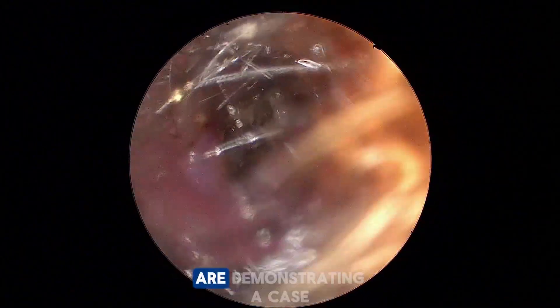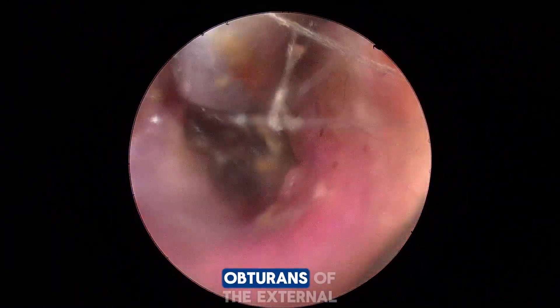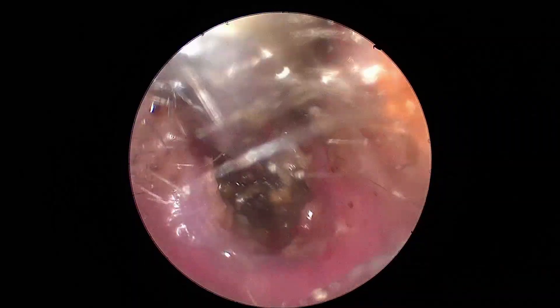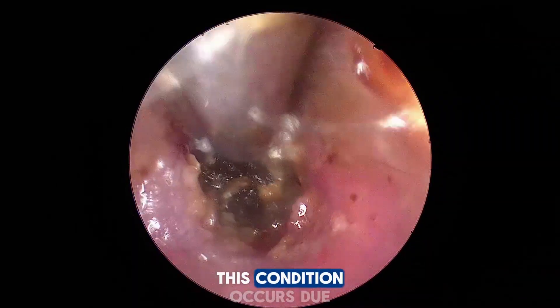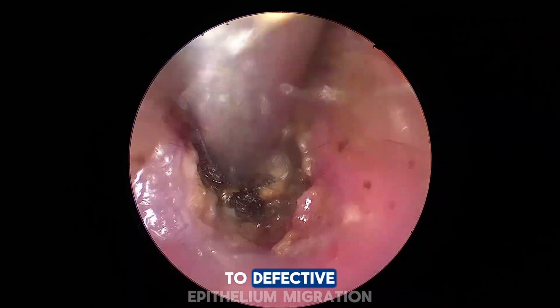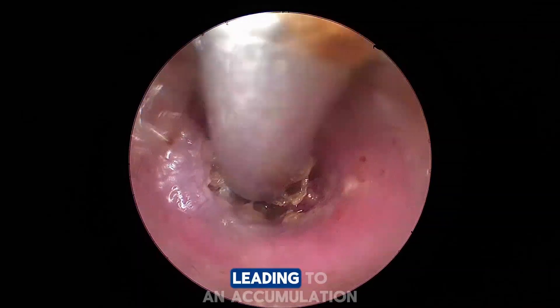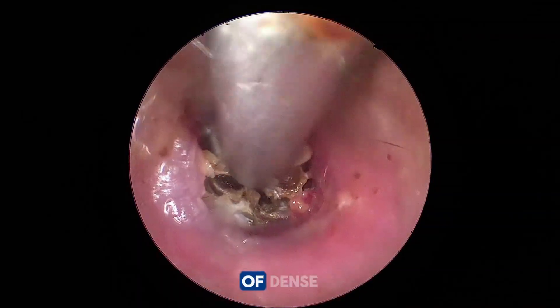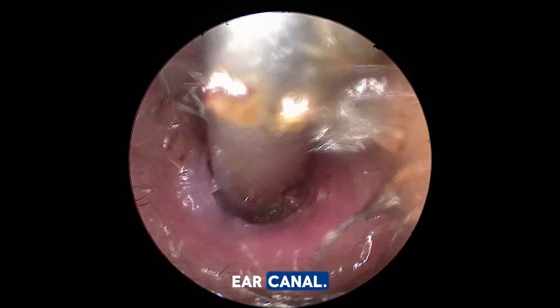Hello everyone, today we are demonstrating a case of keratosis obturans of the external auditory canal. Unlike simple wax, this condition occurs due to defective epithelial migration, leading to an accumulation of dense keratin debris within the ear canal.